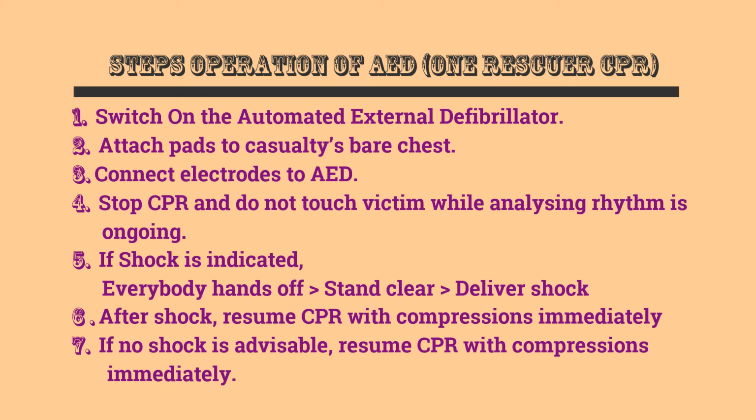If a shock is indicated, everybody hands off and stands clear. Deliver the shock by pressing the button. After the shock, resume CPR with compressions immediately. And if no shock is advisable, resume CPR with compressions immediately.